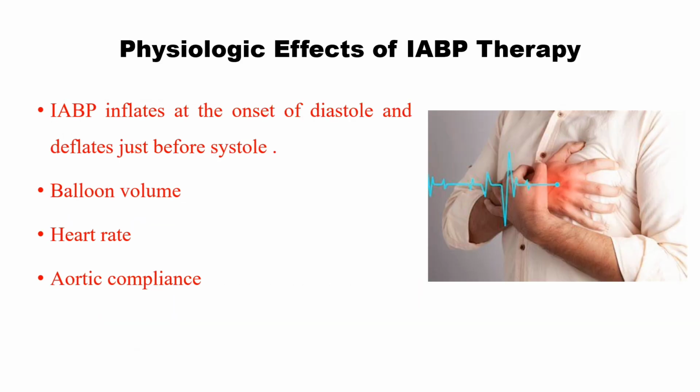We'll see the physiological effects of IABP therapy. The intra-aortic balloon pump inflates at the onset of diastole and deflates just before systole. These effects depend upon the balloon volume, heart rate, and aortic compliance.